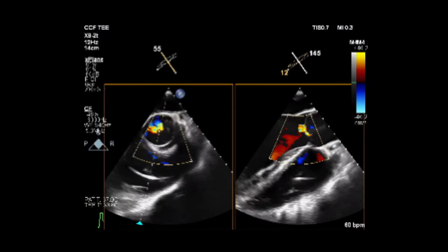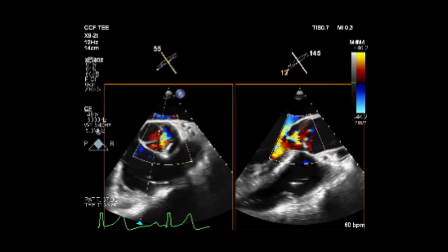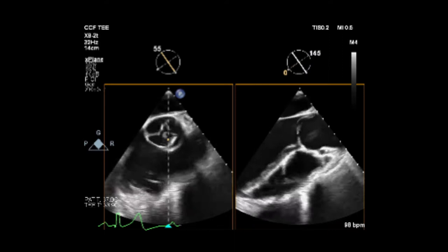This is a young 27-year-old patient with severe aortic valve regurgitation from a bicuspid valve. There's prolapse of the leaflets, lack of coaptation, and also an area where there is not a conjoint and symmetrical fused leaflet. The first step is to look at the valve and understand the anatomy — remember that from echo, that's usually not very good.